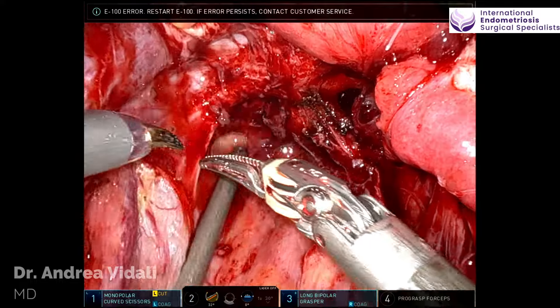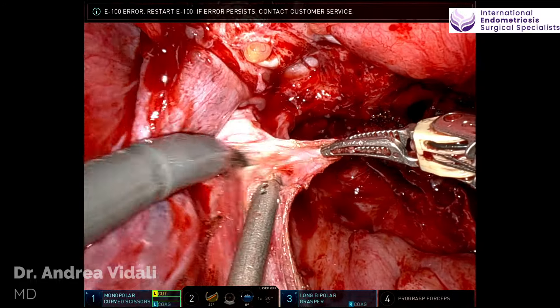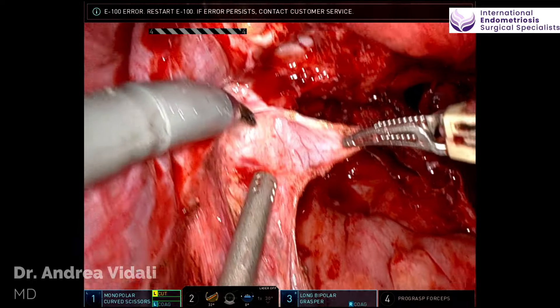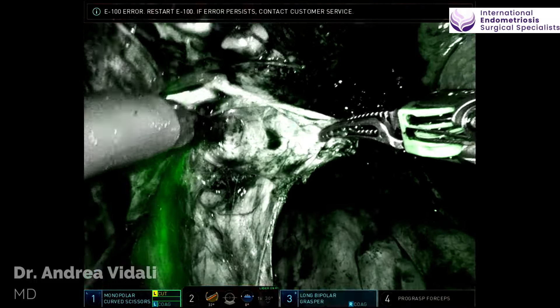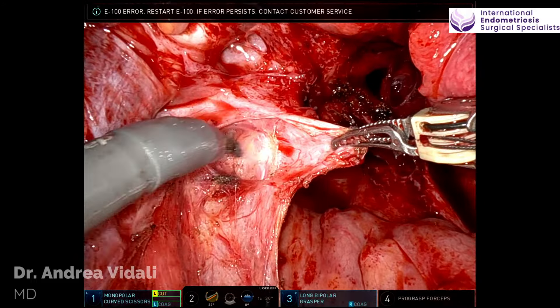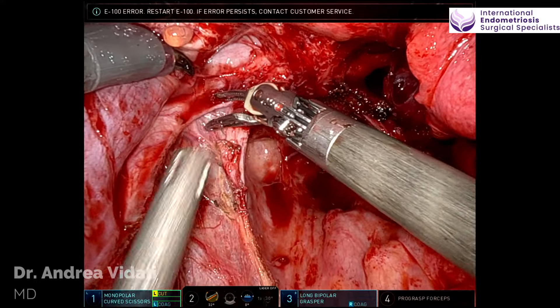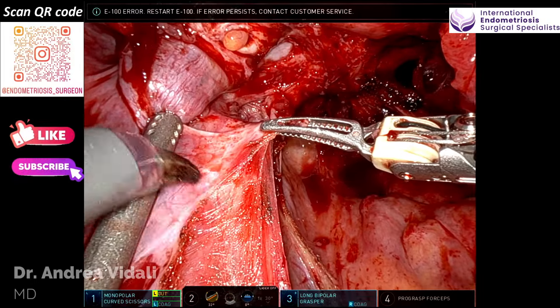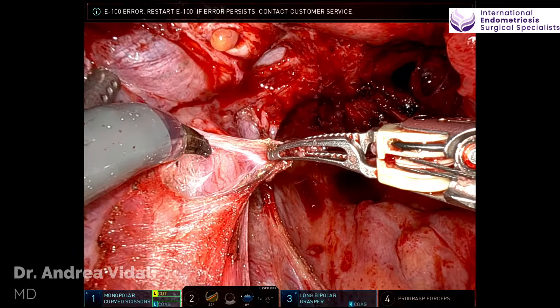I rely heavily on my assistant with suction and traction on the bowel. It is important to remember that although one is very independent robotically, the assistant can really facilitate your operation greatly. In this operation, I'm only using two instruments, which is somewhat common for me. Sometimes I like to use two, sometimes I like to use three.